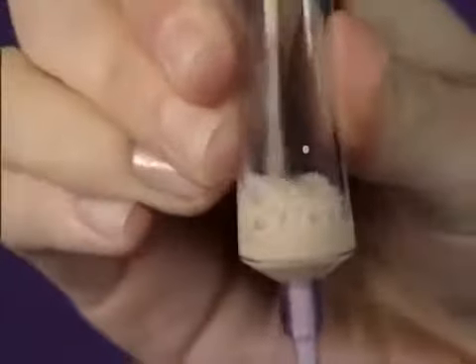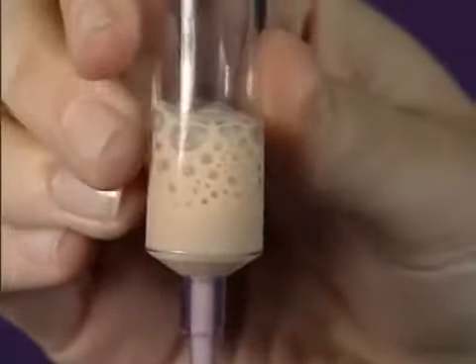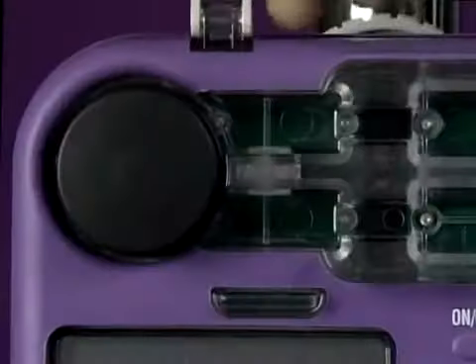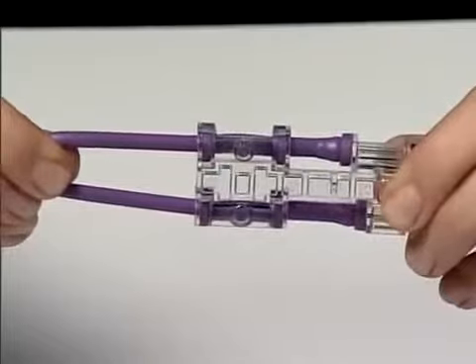Squeeze the drip chamber until it's about a third full. Open the pump door by gently pressing the release catch at the bottom of the door. Lever the door fully open. The pump insert on the giving set is designed to fit in the pump one way.